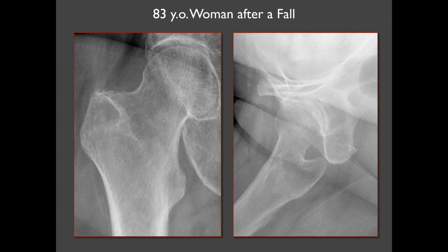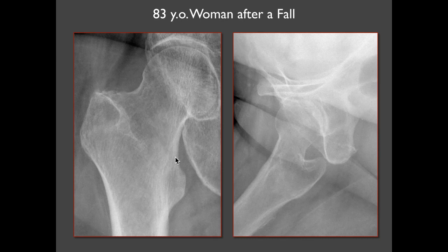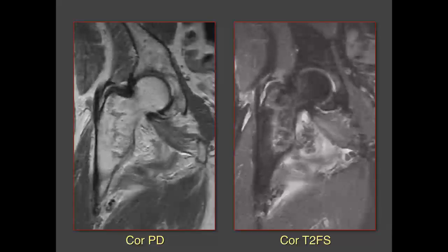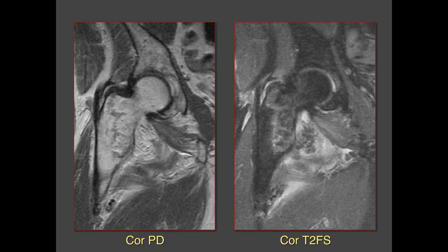Here's a different patient — another older woman after a fall, with hip pain, unable to bear weight, and high suspicion for fracture. Very difficult to detect a fracture here — you can see the trabeculae running along the femoral neck, follow the contours on the true lateral view, no obvious cortical break or lucency. In this setting it's not uncommon to do CT or MRI to detect a radiographically occult fracture. MRI of that right hip showed an irregular line in the intertrochanteric region on proton density, and on the T2 fat-suppressed image there was irregular signal with surrounding edema, confirming an intertrochanteric fracture.